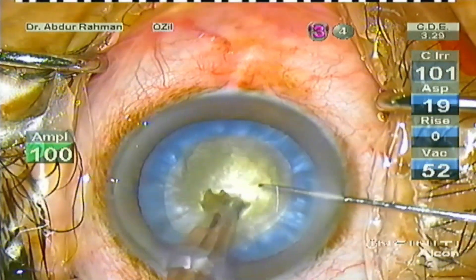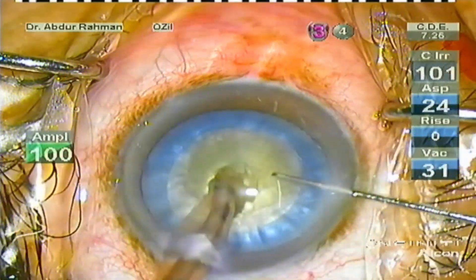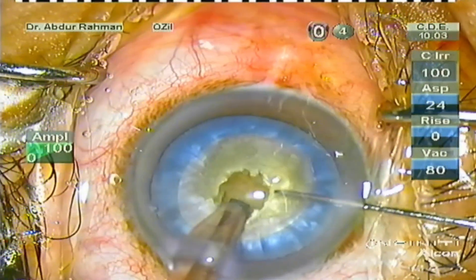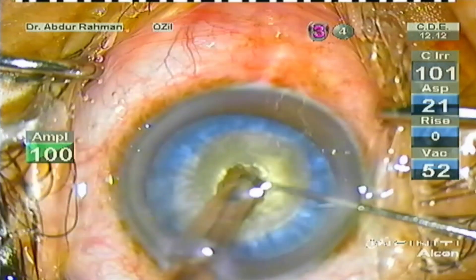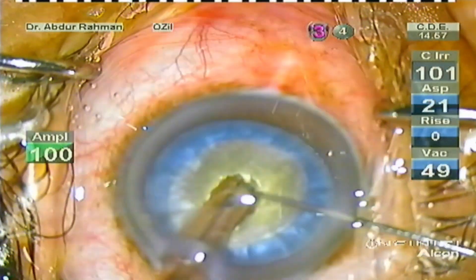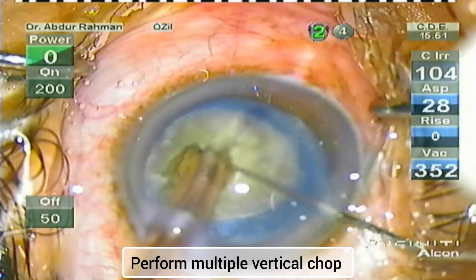Then I groove out the central pit for modified chop. In sculpt setting I'm using 100% energy to punch a hole in the endonucleus. I'm sculpting about two-thirds of the nucleus and going deep inside the nucleus until I see the silvery reflex of the posterior plate.